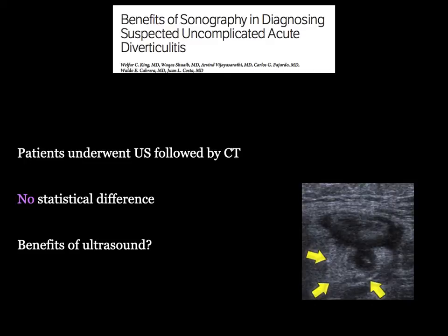So again, patients all underwent a point of care ultrasound followed by a CT scan. Again, there was no statistical difference between ultrasound and CT scan in making this diagnosis. The obvious benefits of ultrasound would include the shortened length of stay in the emergency department, the reduced cost for the patient, and that there was no radiation exposure.